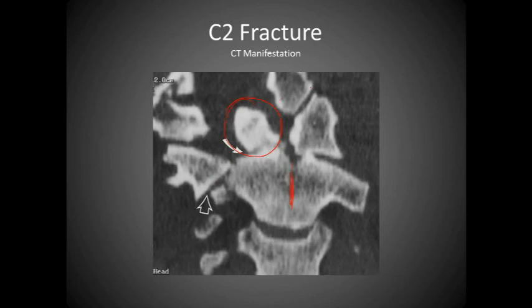And if we notice, it looks like the head has been flexed over to the right in this coronal image. And so that's caused this. Notice we have narrowing here and widening here. So it's a very severe fracture. It's questionable as to if this patient actually survived based on what it looks like.